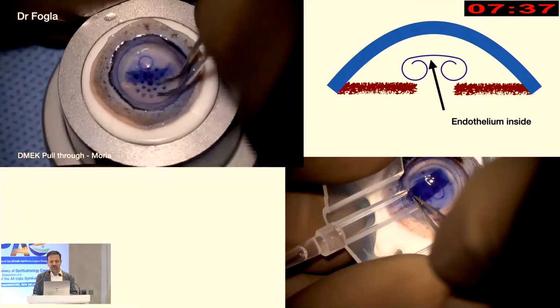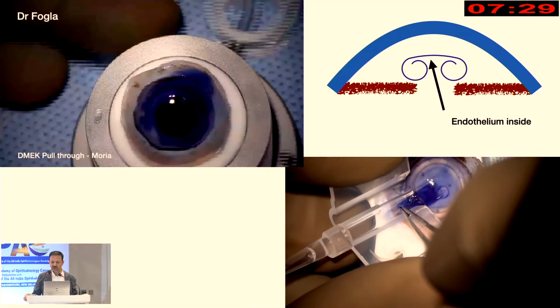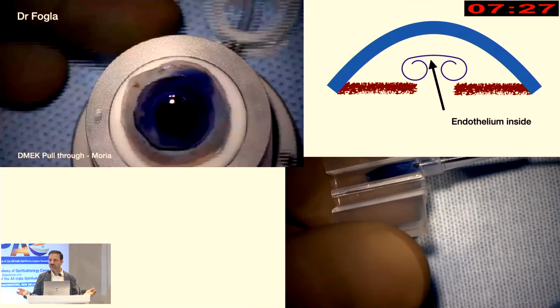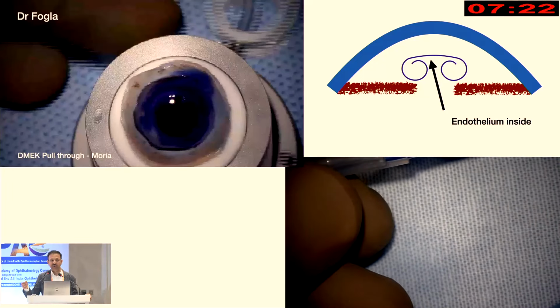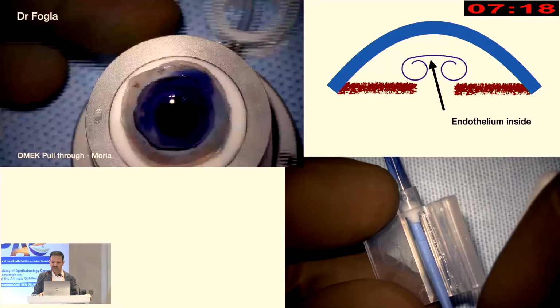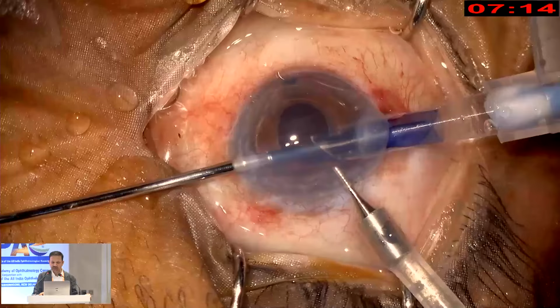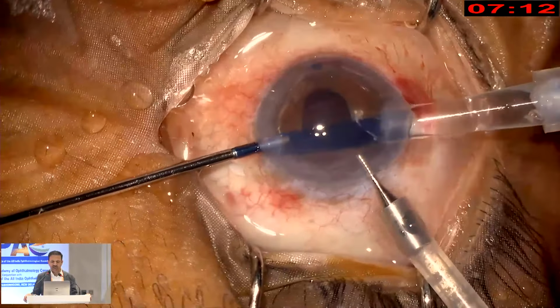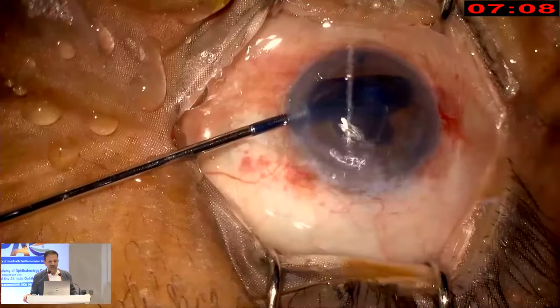So here you are basically physically folding the graft endothelium inside like a DSEK graft. And this can then be transferred onto an IOL cartridge. So the endothelium is not on the outside like a conventional scroll, but on the inside. And then you can use a microforceps to bring the tip of the DM scroll forward. And then you can pull the scroll into the eye just like you do with the DSEK graft, but don't let go.